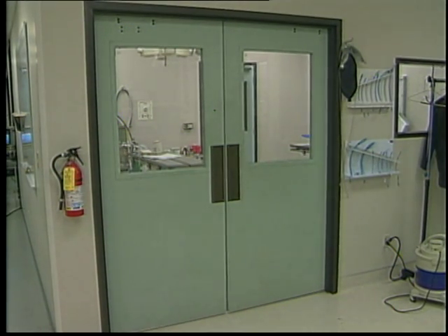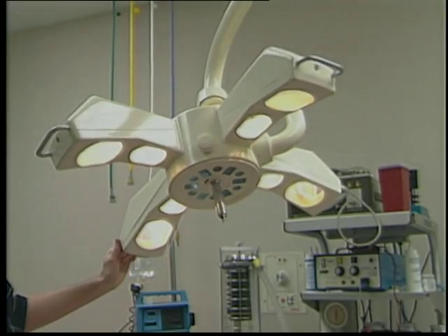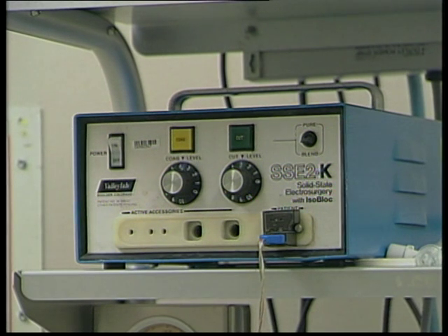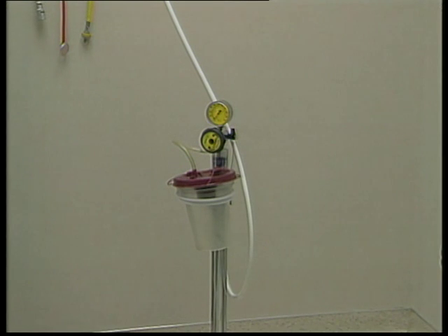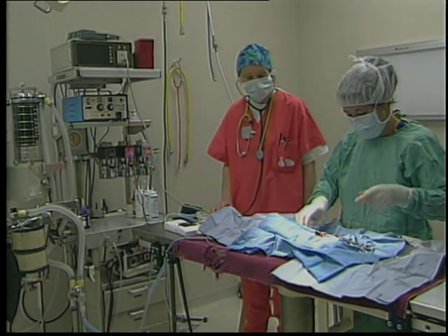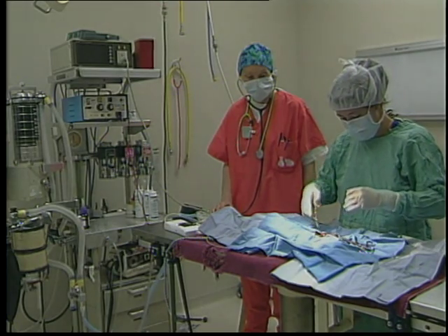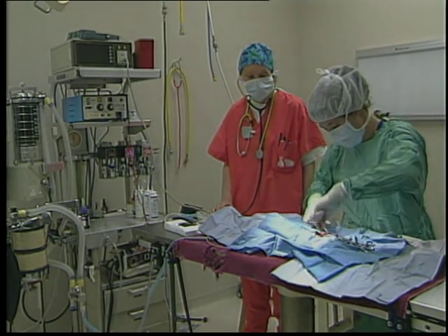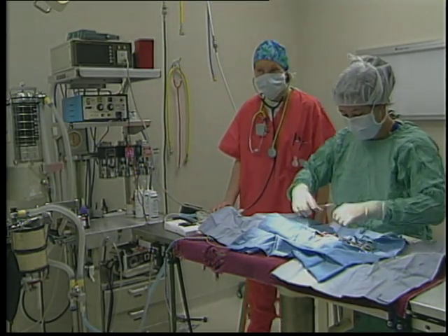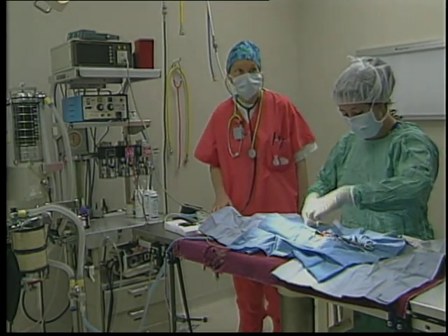Other items that are located in most surgery suites are the surgical light to provide good illumination of the surgical site, a cautery unit used to electrically burn tissue and blood vessels in order to stop their bleeding, and a suction unit to suction away blood and other fluids so the surgeon can more easily see what they're doing. These and other instruments all work together in harmony with the surgeon and their skilled assisting team to provide the amazing miracle we call veterinary surgery. With the skills you've been oriented to thus far, you can begin the process of being a valuable addition to the surgery team.